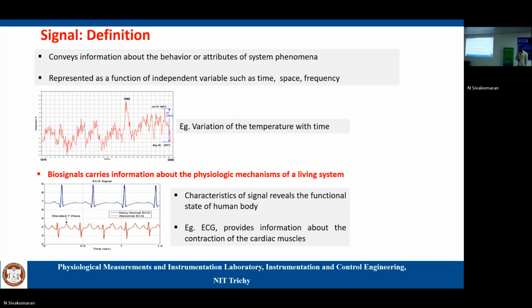But what is important to note is whether the system that records does its function properly. For example, the heart is functioning properly, but the system has some sort of malfunction, then the resultant ECG will be abnormal. You got my point.